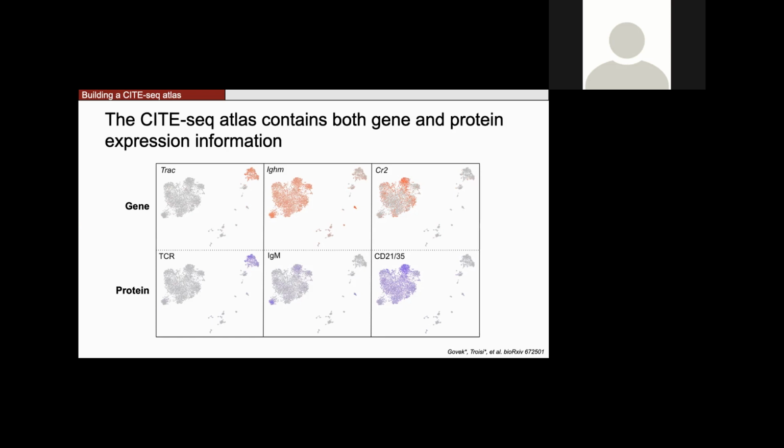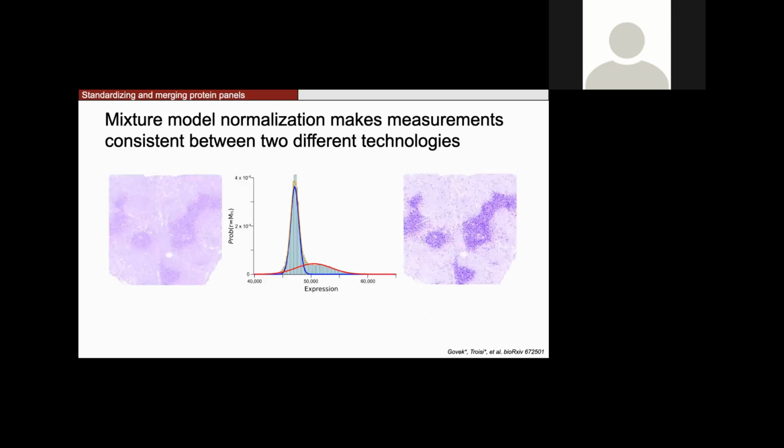And this is weighted mapping. So we essentially just take the weighted average of the CiteSeq expression profiles that are associated to a given codex cell. There are a couple other ways that we thought about doing it, and that's another thing that we want to do in the future, exploring what's the best way of calculating the codex expression profiles.